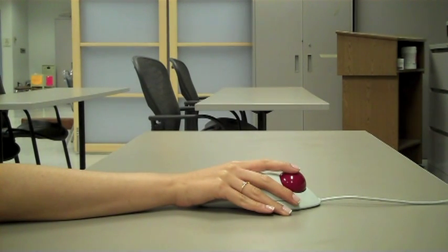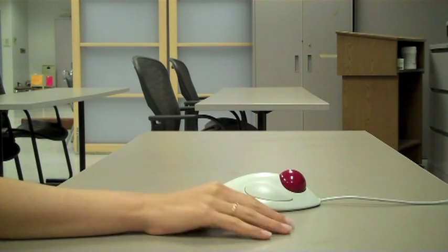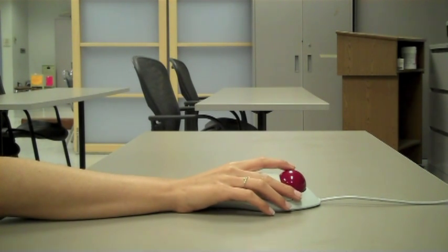Looking at the side view, notice her wrist is extended in this position. Wrist extension can be minimized by using a hand rest.